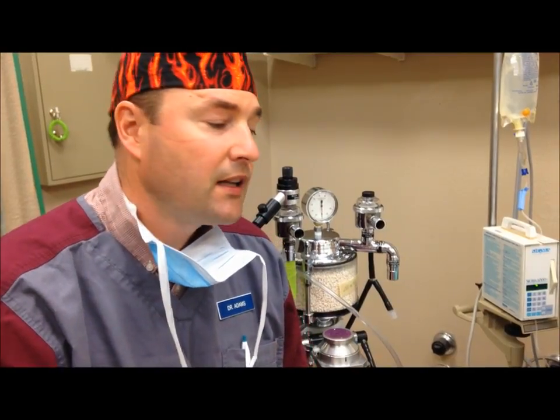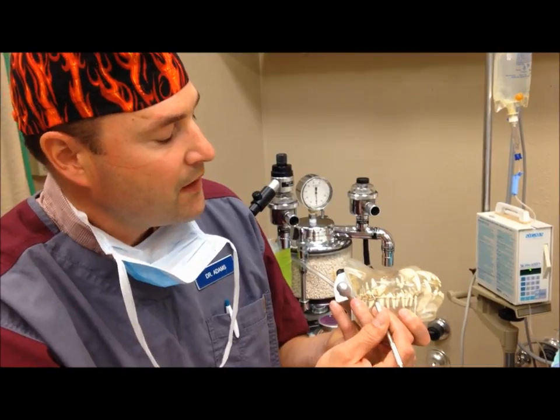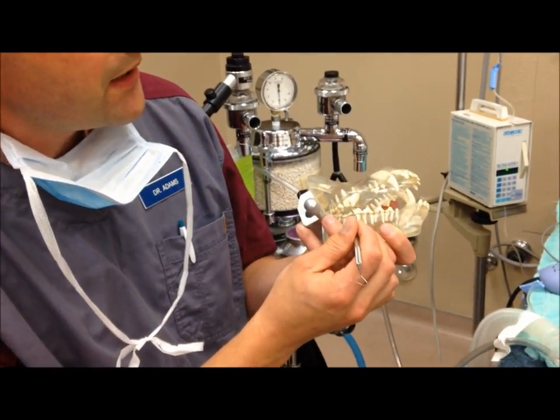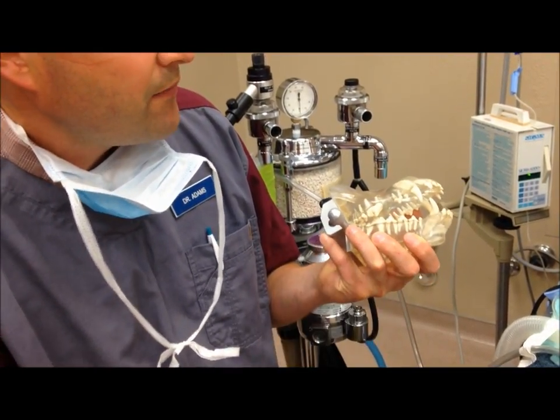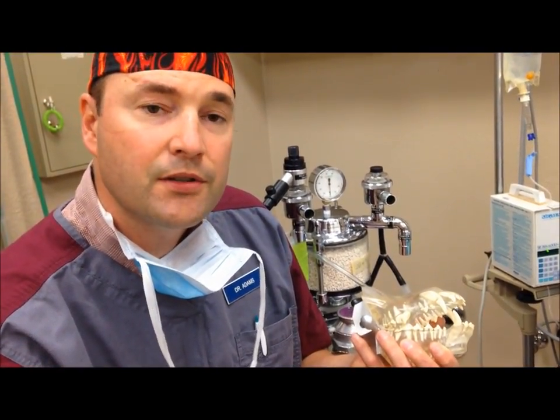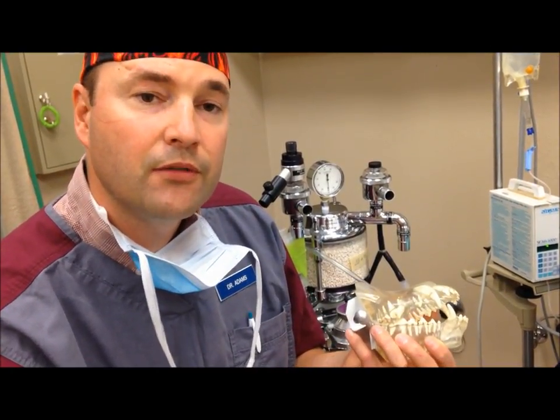I'm Dr. Craig Adams at Poulsbo Animal Clinic. Today we extracted the upper fourth premolars from Riley. Riley's a little papillon who fractured that tooth. Dogs commonly will fracture their upper fourth premolar when they bite down on something hard, and he developed what are called slab fractures. Slab fractures generally require root canal or extraction to treat them properly, and in this case the owner elected for extraction. I'd like to walk you through the process for what we just did a few minutes ago in Riley.